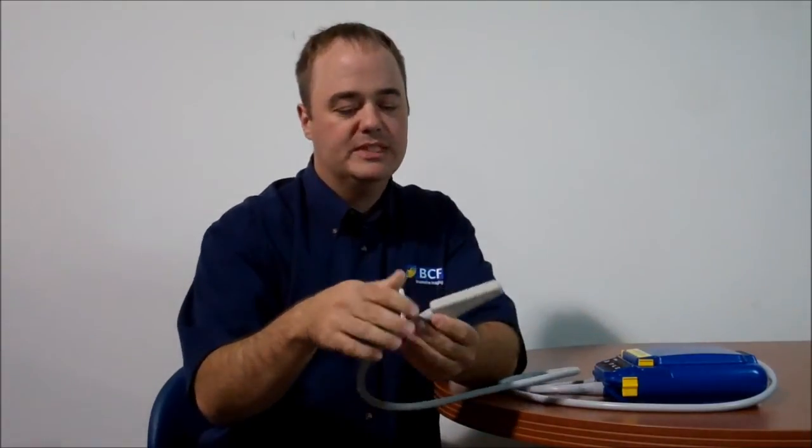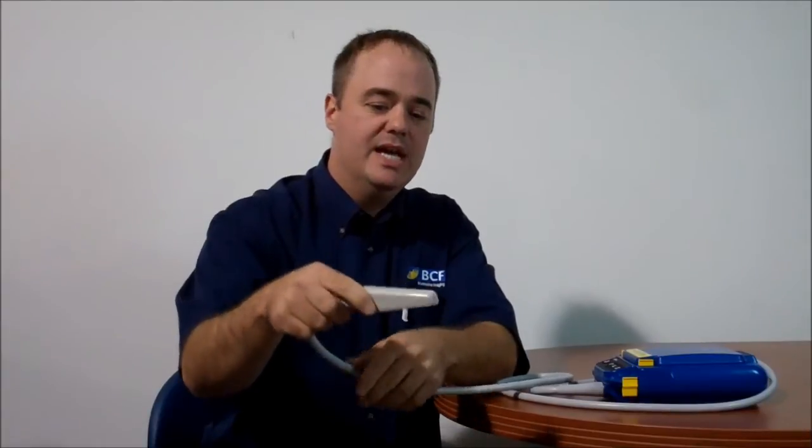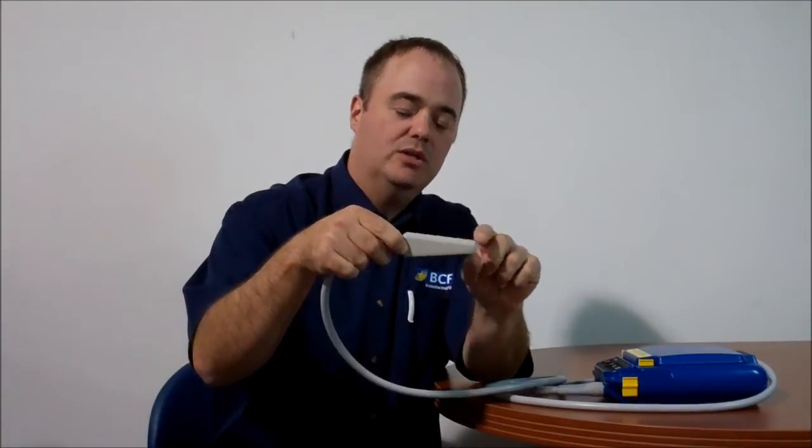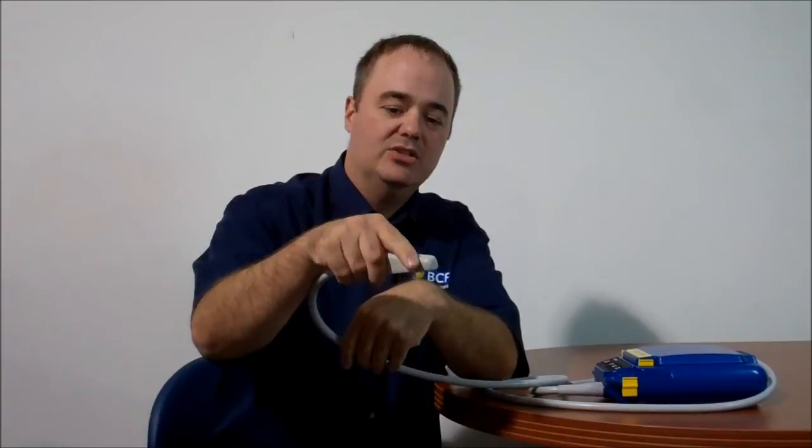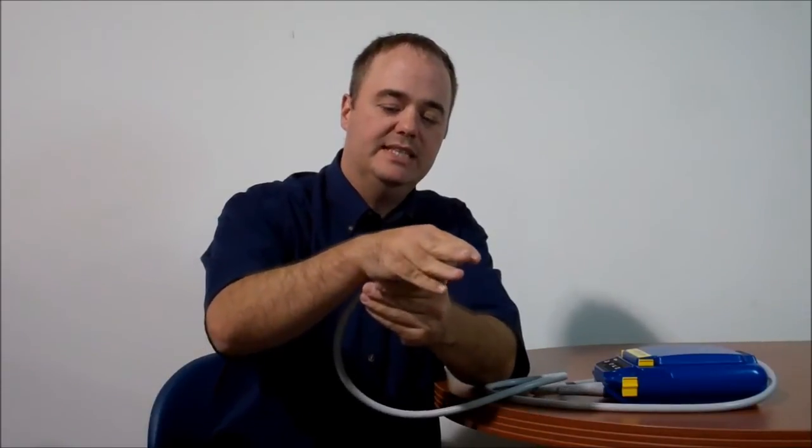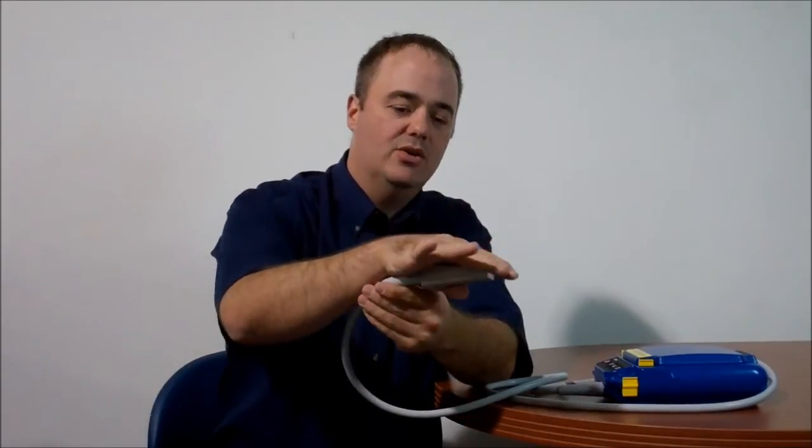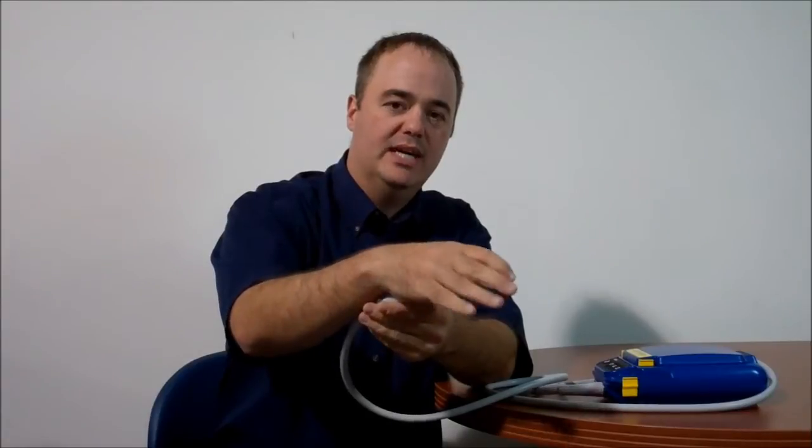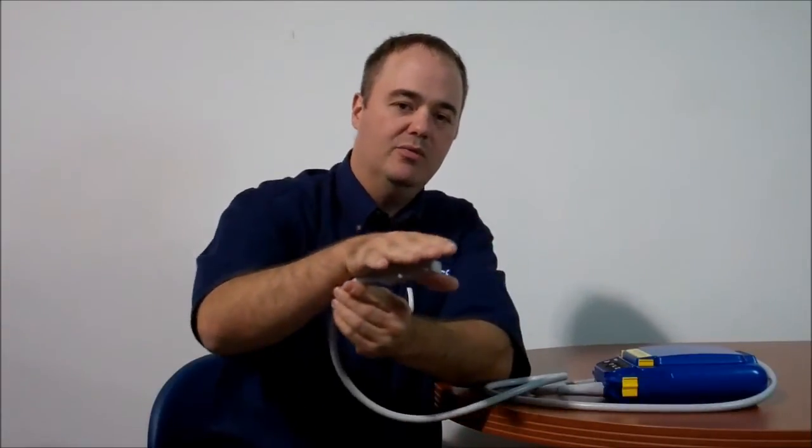Another advantage is the probe itself is very ergonomic. As you can see, the end is smaller so it's easier to initially insert into the cow's rectum. Also it fits into the palm of your hand, so it's easy to manipulate the probe inside the cow and as well guide it with the palm of your hand.